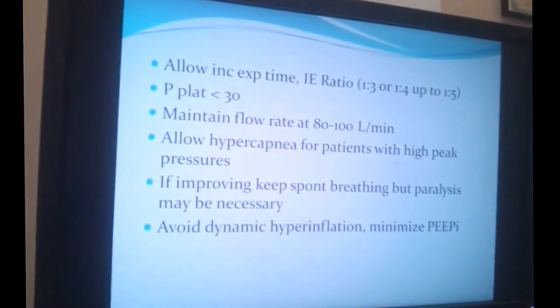Whereas on the Oxylog 3000 Plus, when you turn the machine on, the default is that the autoflow is off. So you need to go into settings, I think it's page 3 or 4, and then you turn on the autoflow. Okay? That's extremely important. Whenever a patient is intubated and ventilated, turn on the autoflow. How would you see if the autoflow is not on? So see the inspiratory waveform. If it's a square wave, it's likely that the autoflow is not on. Okay? Sweet.